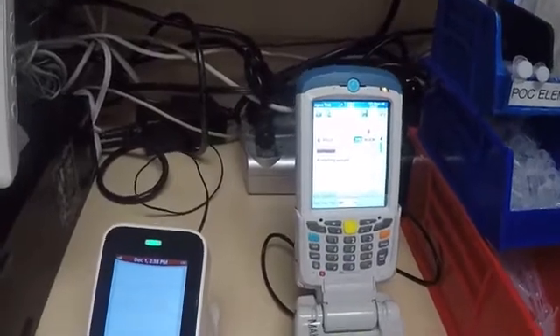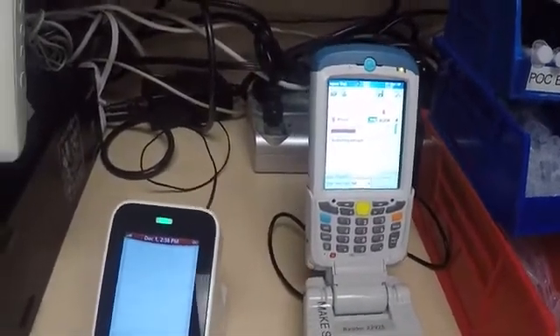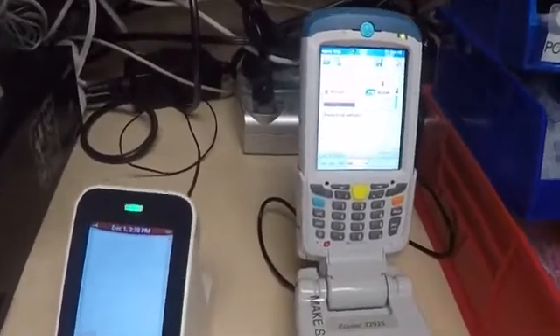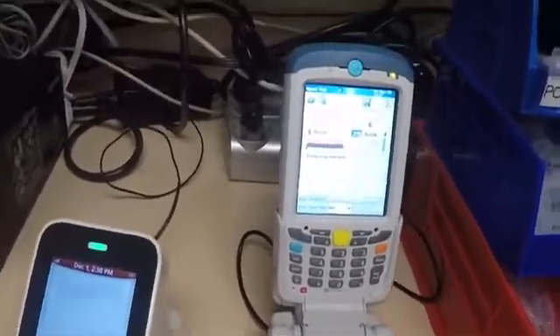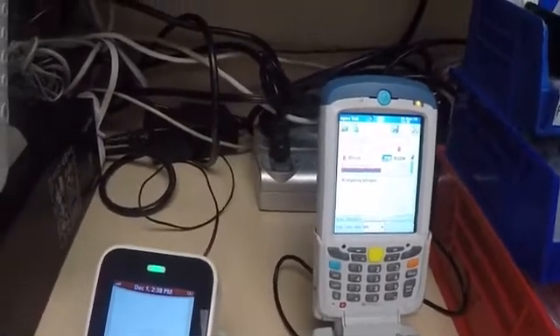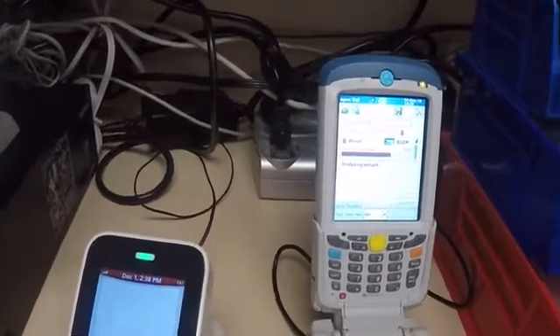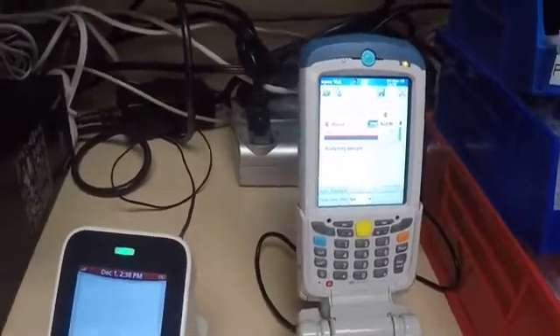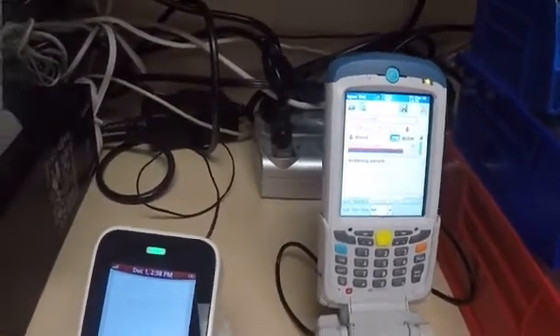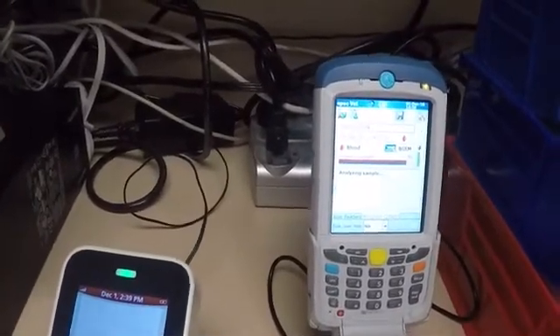It takes about a minute. Once our results are up, we're going to go ahead and transfer them to the computer. This analyzer communicates via Bluetooth, so it uses another piece of equipment alongside EZVET, which I'll show you in just a second.